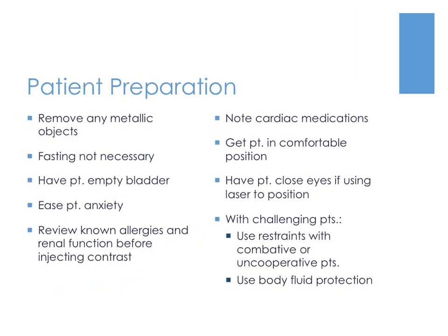So the patient preparation is just about the same for any other anatomy. This is the slide that we first saw in the CT head and cerebral vessels lecture. So you need to remove any metallic objects. Fasting isn't usually necessary, although don't have them come on an empty stomach if they will be receiving contrast, as it might make them nauseous. Have the patient empty their bladder. Ease the patient's anxiety by explaining the exam thoroughly. Review the known allergies and renal function before injecting contrast.